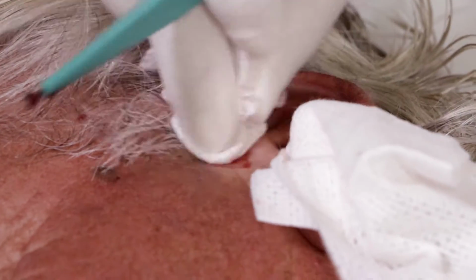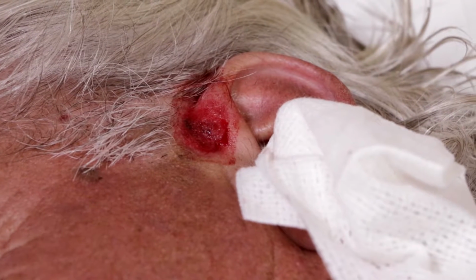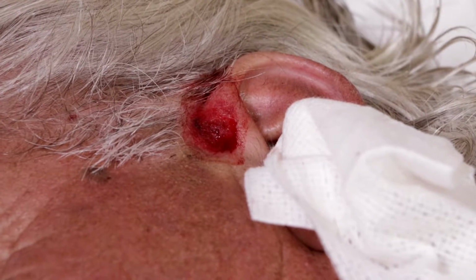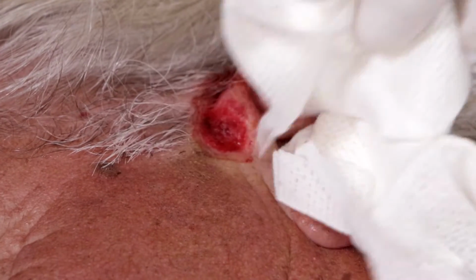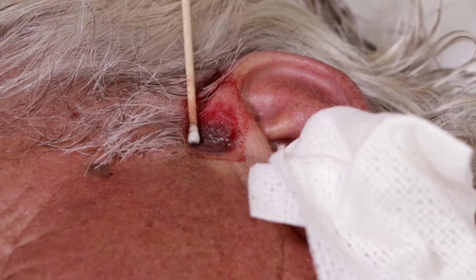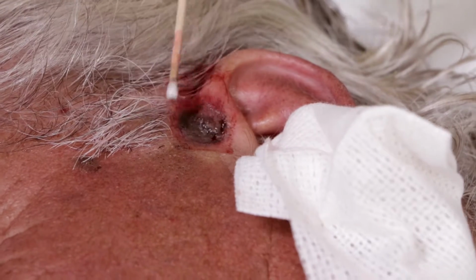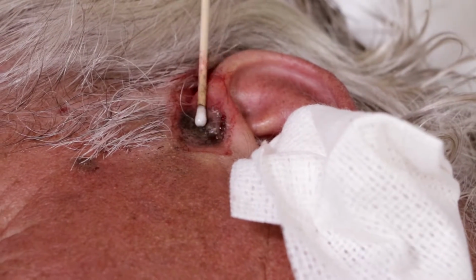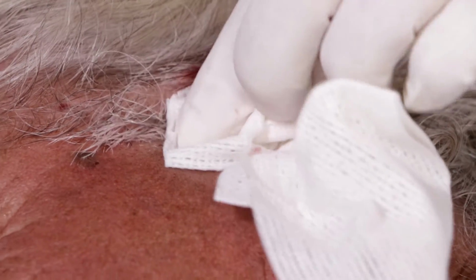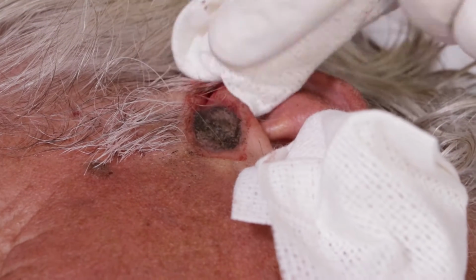All right. We're going to do the cautery again. Yeah, I'm glad it's not bleeding a lot. It's pretty much right on the surface. It is. It's very superficial. Partial thickness, as they call it. All right. Number 3.